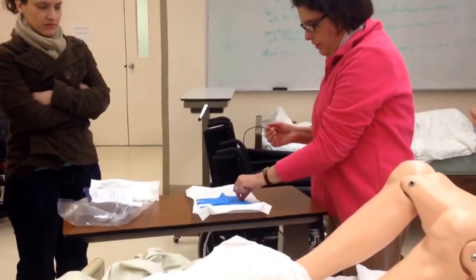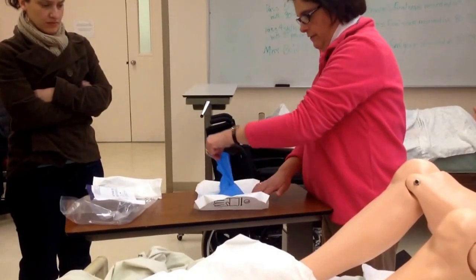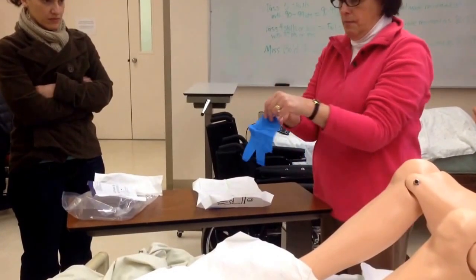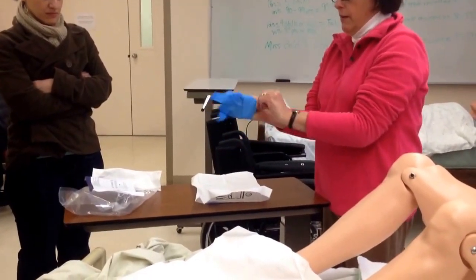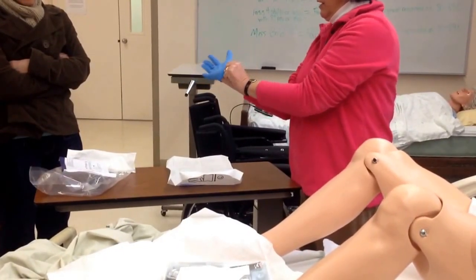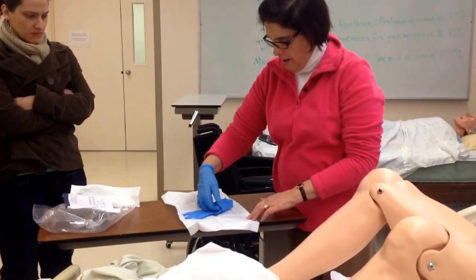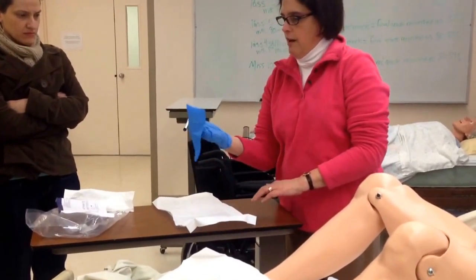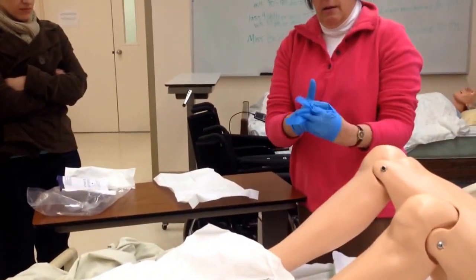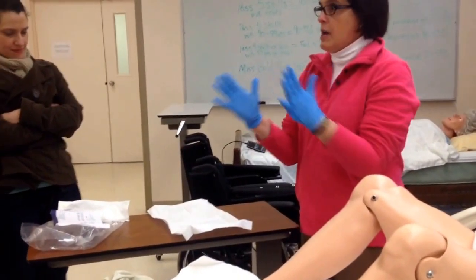So you pick up the glove at the fold of the cuff, okay? And you're going to put your thumb inside your palm, and you're going to slip the glove on, and then pull the cuff up like so. Then you are going to go underneath the cuff of the other glove. Your thumb is out. You're going to stick your thumb in again and pull up. Ta-da! Okay, now you've done this.